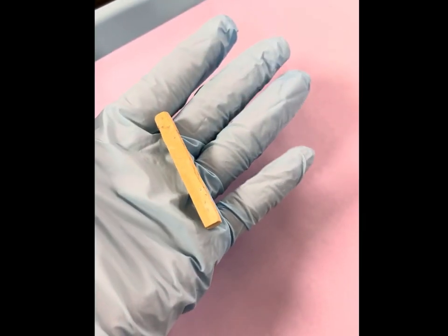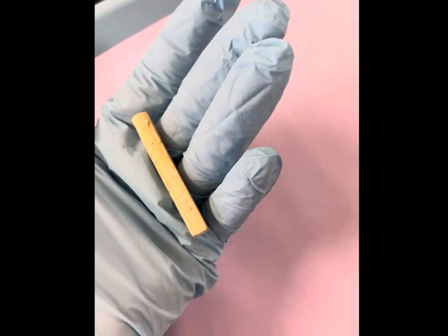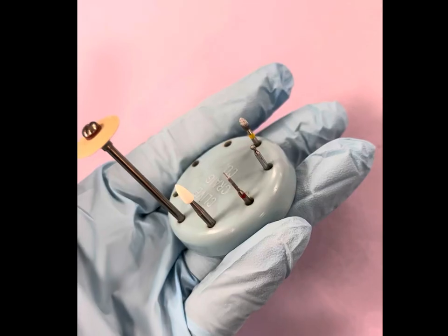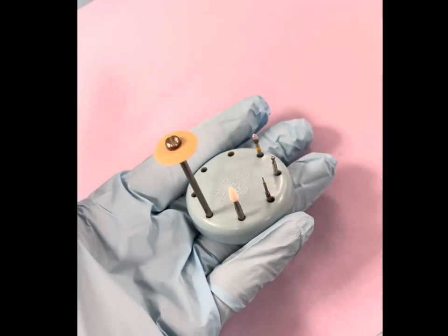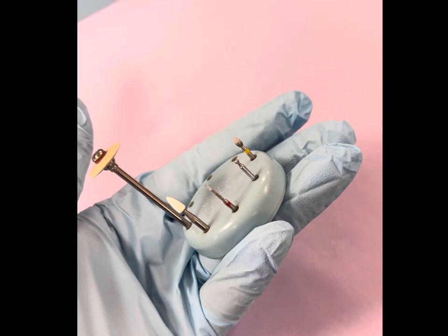The purpose of the bite block is to protect the patient during the procedure, especially when they are waking up from the anesthetic. We will then have the proper burrs that we need. For the preparation tray, we will need diamonds to prepare the teeth. This also includes our finishing burrs, finishing discs, and our finishing stones.